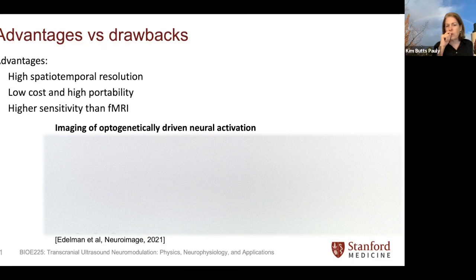And I wonder if the noise that you're seeing on the upper line, if you look before the stimulation and the curve's going up and down and that's quote noise, is that noise as in electronic noise or noise as in physiological noise? Because electronic noise, you can always do better if you get a better coil or you do your imaging better. But if it's physiological noise, you can't necessarily do any better. Do you know?